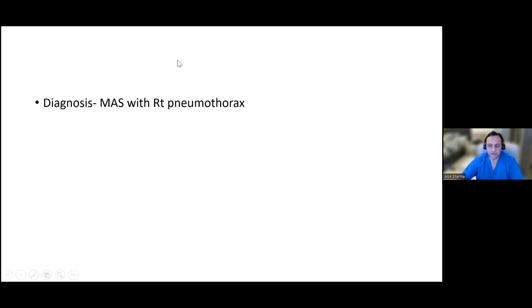In terms of what can happen in a time period, I'm giving you a very simple example. I've done a lung ultrasound in a baby who has respiratory distress on CPAP, which basically looks like transient tachypnea. But you repeat the exact same lung ultrasound half an hour later because the baby has more respiratory distress, and the baby has now developed a pneumothorax. So it's very dynamic, and you can have changes very, very quickly. If you're on positive pressure and you have a pneumothorax, it can evolve very quickly. Sometimes it takes a little bit more time, so sometimes you have to do serial scans. But say for lung recruitment that I'll describe today, you have to keep your probe there to actually see how things are changing. So, well done.